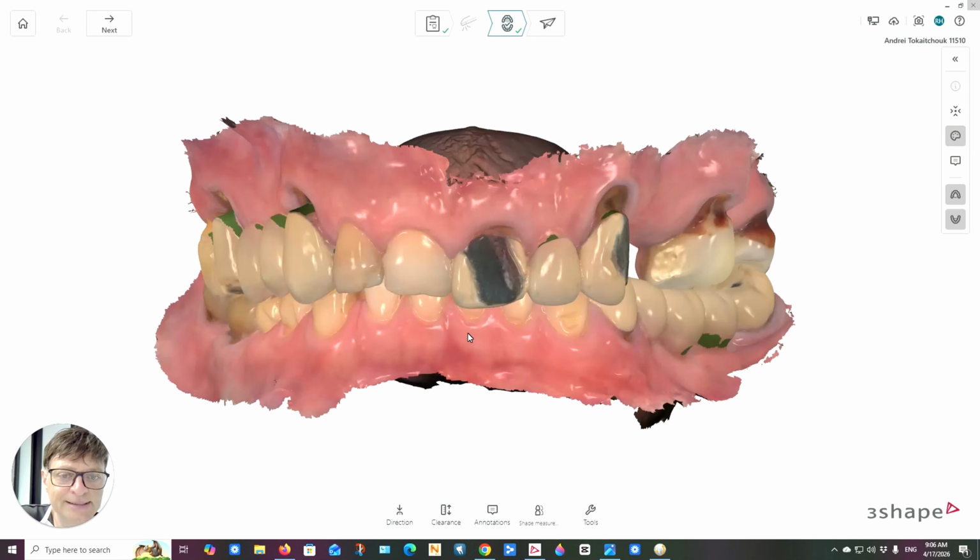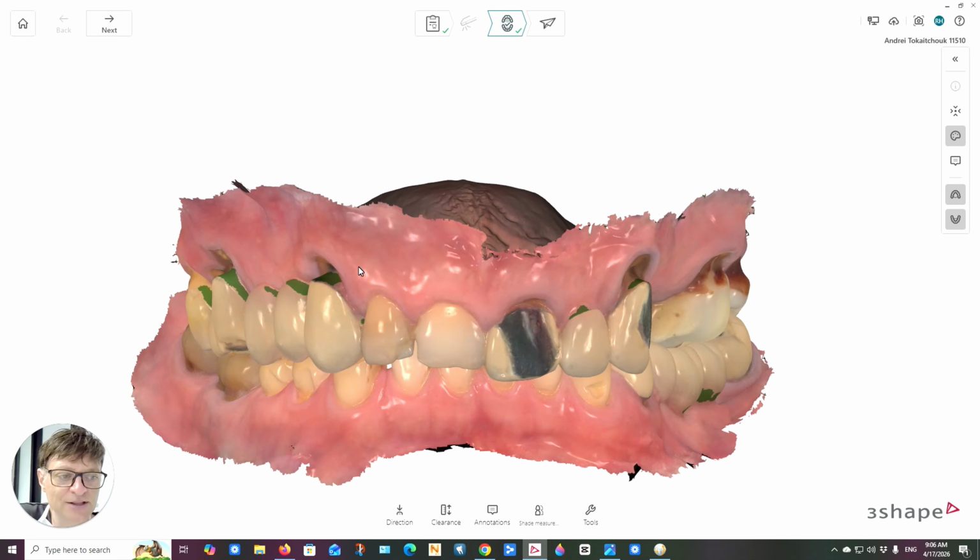And this is just some of the digital tools we use to create models, which we use then to design our implant stents, as well as designing the final outcome from the beginning. So we try and get the ideal outcome out of the photographs and the scans, which we place together on the digital smile design platform, and then we work backwards from there to try and restore and rebuild what was lost. So this is what we did.